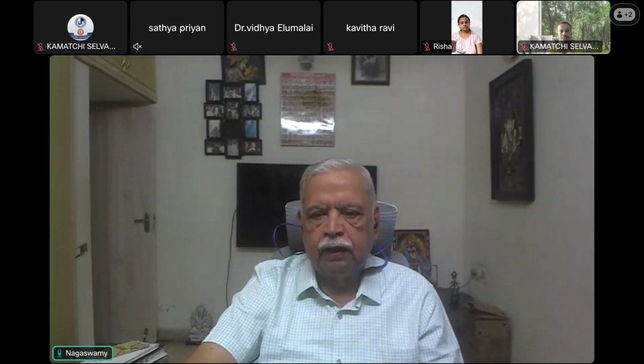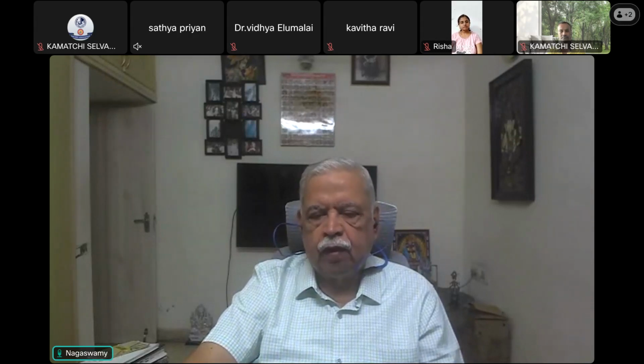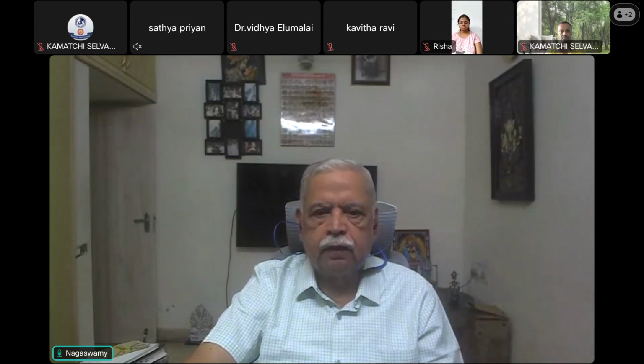And from the common gas outlet, it will be delivered to the patient by the breathing systems. So we have seen up to the common gas outlet in the last class, sans the vaporizers. We have not discussed about the vaporizers because I told it was a huge topic by itself.